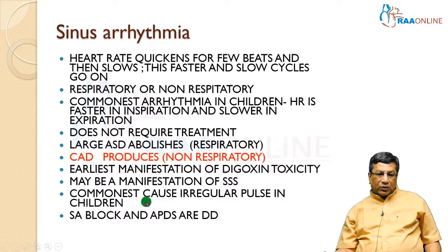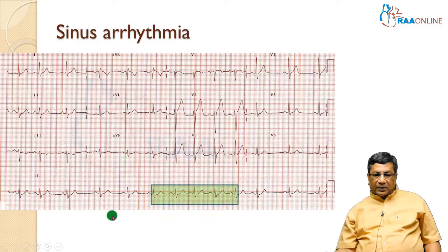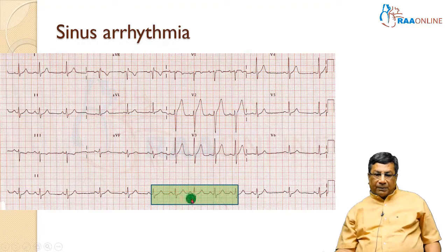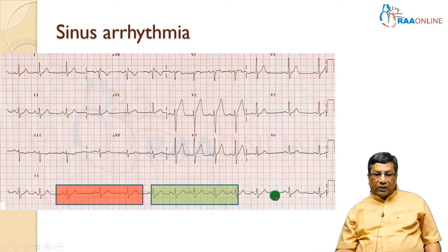Sinus arrhythmia is the most common arrhythmia in children and the most common cause of irregular pulse in children. Here I am showing you an ECG of sinus arrhythmia. During one period of this recording, the patient has got a heart rate of almost 100 per minute. During another phase, the patient has got a heart rate of almost 50 to 60 per minute. Spontaneously, you can see that the heart rate is quickening and slowing down.